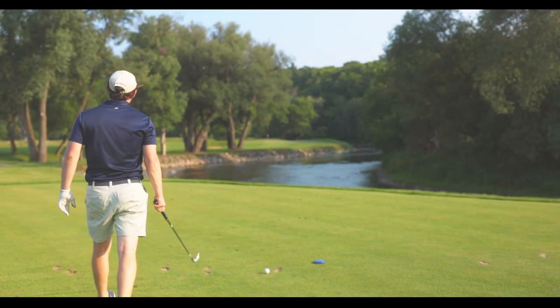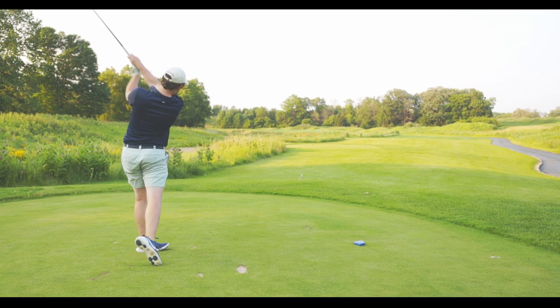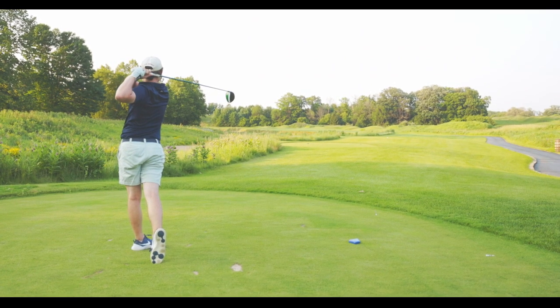Millions of people around the world, including myself, love the game of golf. But there's a group of people out there that just can't enjoy the game like the rest of us. With the help of the Human-Centered Design Studio at the Colorado School of Mines and Bob Radosi from TRS Prosthetics in Boulder, Colorado, our group has worked hard to provide a solution for arm and hand amputees to be able to play golf comfortably and just have fun while doing it.